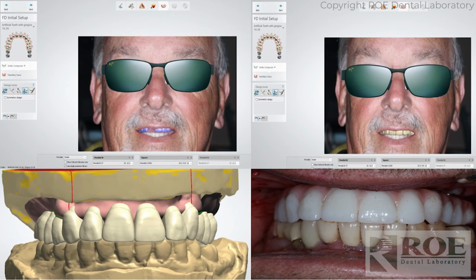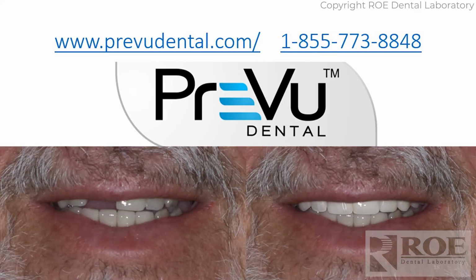We set teeth somewhat according to what we propose. It's not a one-to-one. A one-to-one is very difficult in this industry with a lovely smile photo that we're trying to share with the patient and then making into a perfect reality. So it's not always perfect, and we don't promise that. We don't want to, but we want to at least get close to shape, a little bit close to size, maybe buccal corridor, that type of thing. But then we make a setup, and then we follow that the best we can. And so that's why we want that really nice full face smile.